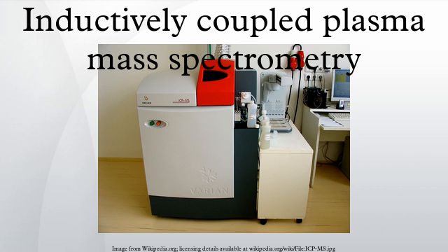Applications: One of the largest volume uses for ICP-MS is in the medical and forensic field, specifically toxicology. A physician may order a metal assay for a number of reasons, such as suspicion of heavy metal poisoning, metabolic concerns, and even hepatological issues. Depending on the specific parameters unique to each patient's diagnostic plan, samples collected for analysis can range from whole blood, urine, plasma, serum, to even packed red blood cells.